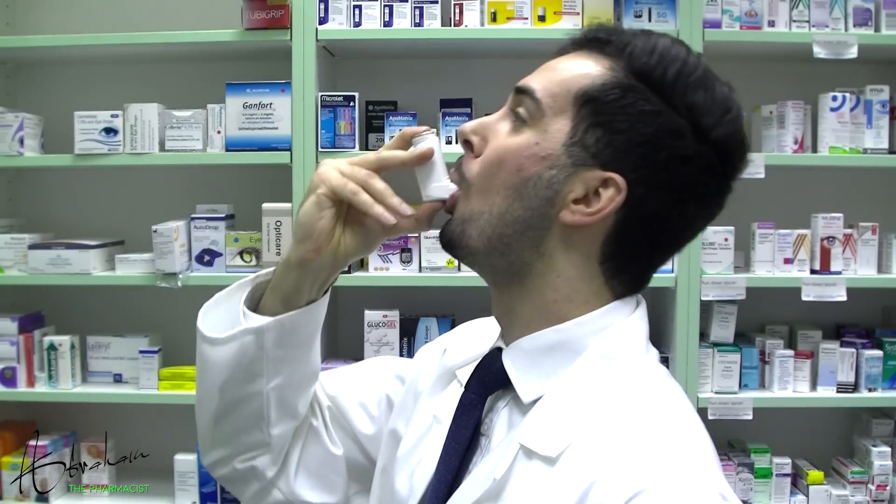It's important to wrap your lips around it and not bite it. Now let's observe the correct inhaler technique in action with commentary. When the mouthpiece is in your mouth, breathe in slow and deep. Just after you begin to breathe in, press the canister down and continue to inhale. Remove the inhaler from your mouth and continue holding your breath for 10 seconds, or as long as it's comfortable, then breathe out gently.